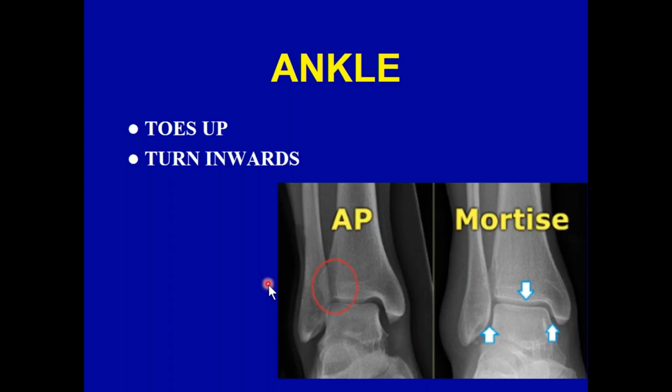So if that's what they want to do, but you have to understand anatomically, the ankle may measure 6 centimeters and the foot might be 4. So because of that anatomic mismatch, the foot will always be too dark. Now, you're in the best position. If the patient says, it hurts around my ankle, you know it's an ankle examination. If they point towards the digits, the metatarsals, you can go back to your doctor one more time and say, the patient pointed to me, there's a big bruise at the metatarsal. Some of your doctors will say, okay, let's do a foot examination. Others will say, just leave it, I want an ankle.